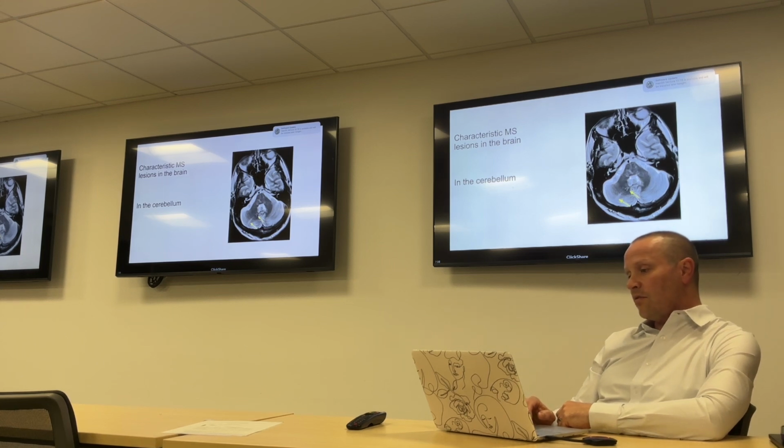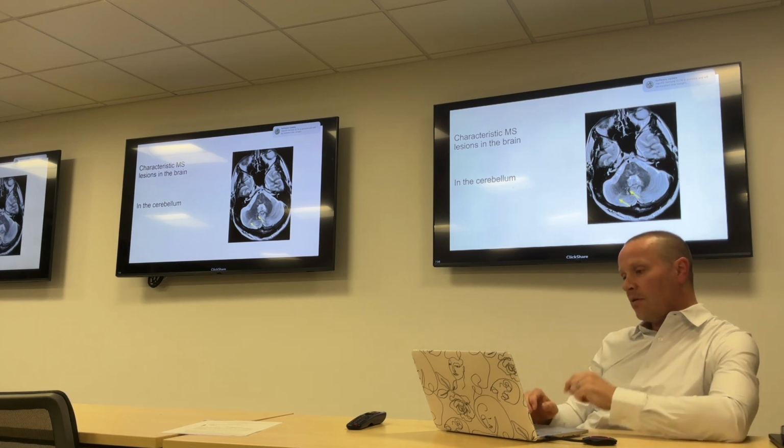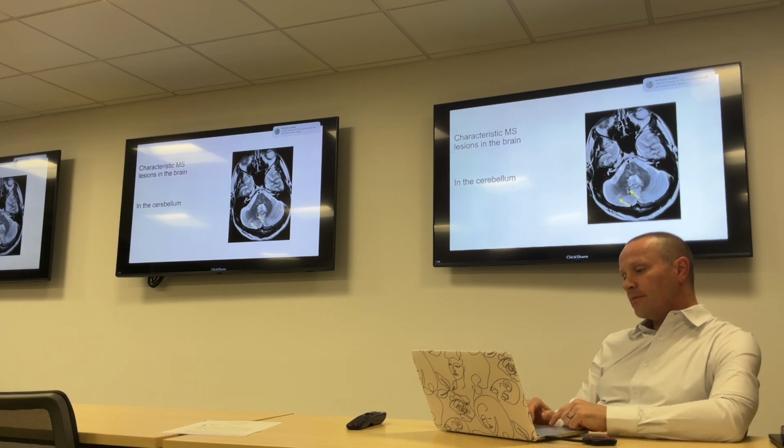And here's the gentleman from the other week. He has these little lesions in his right cerebellum. Sometimes they can be kind of hard to see. They kind of fade away as you scroll up and down, but those are definite MS plaques for sure.